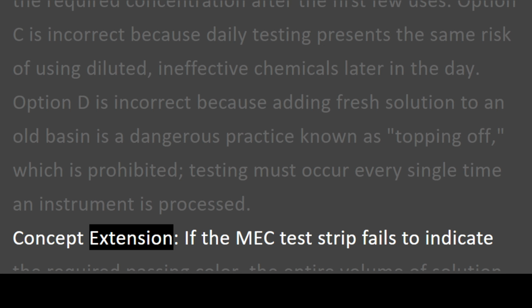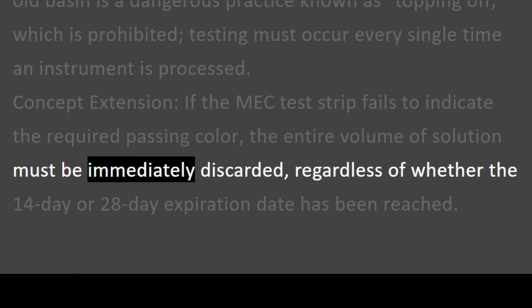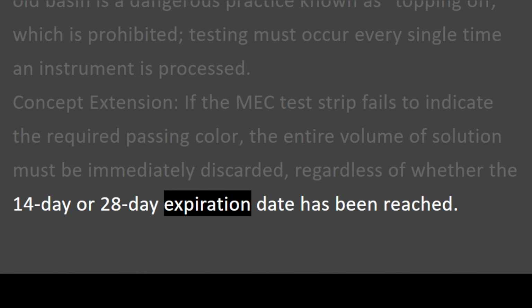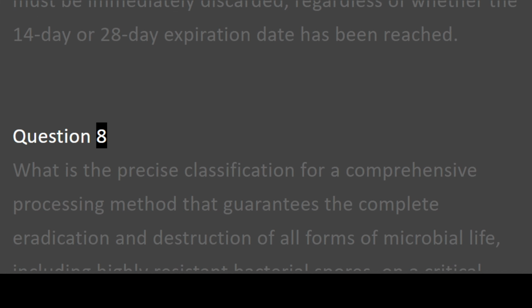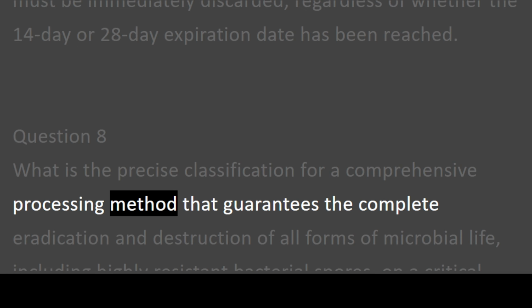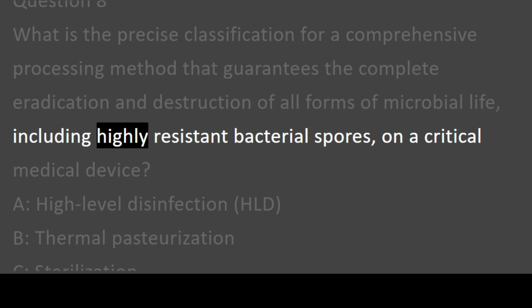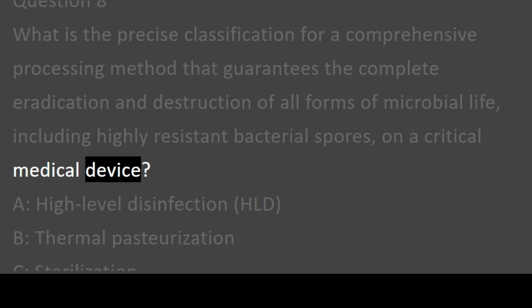Concept extension. If the MEC test strip fails to indicate the required passing color, the entire volume of solution must be immediately discarded, regardless of whether the 14-day or 28-day expiration date has been reached. Question 8. What is the precise classification for a comprehensive processing method that guarantees the complete eradication and destruction of all forms of microbial life, including highly resistant bacterial spores, on a critical medical device?